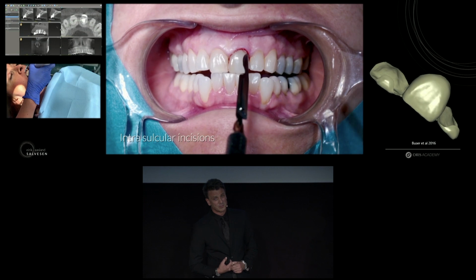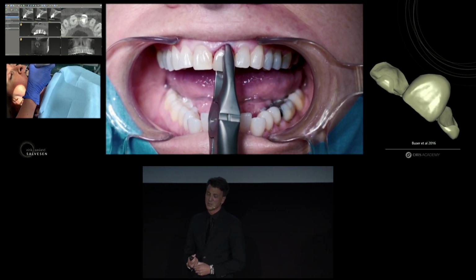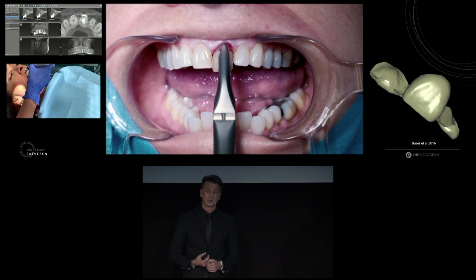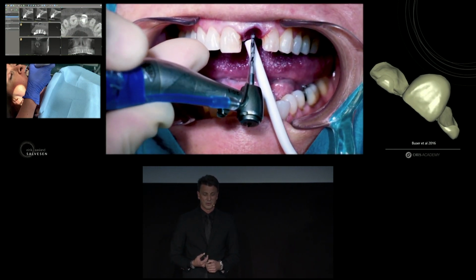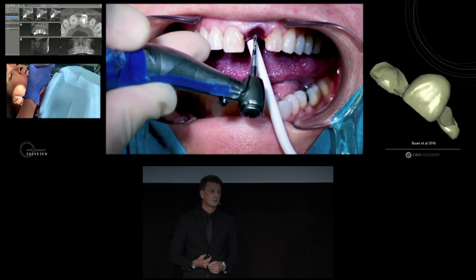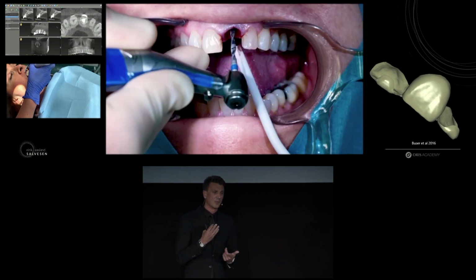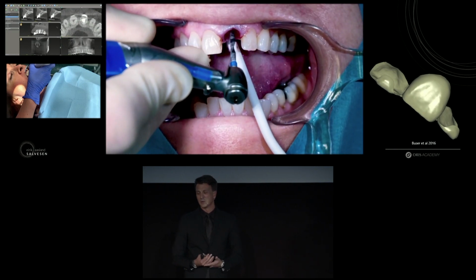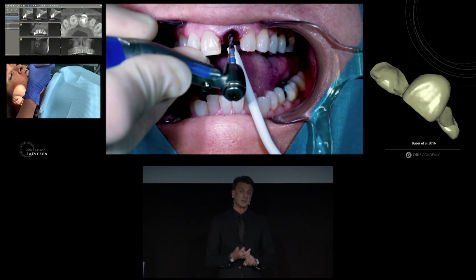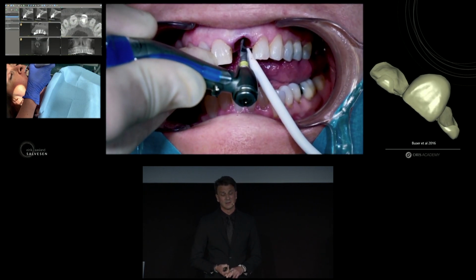And this is just a minute video of the surgical procedure that we do, minimally invasive. As we cut away some of the fibers, we do a careful extraction of the tooth. We use the pilot drill or the needle drill or the precision drill, so we don't use these round burs anymore to make the opening in the cortical bone. And then you will find the same colors. If you're a Straumann user, you will recognize the 2.2 is the blue one, 2.8 is the yellow one.